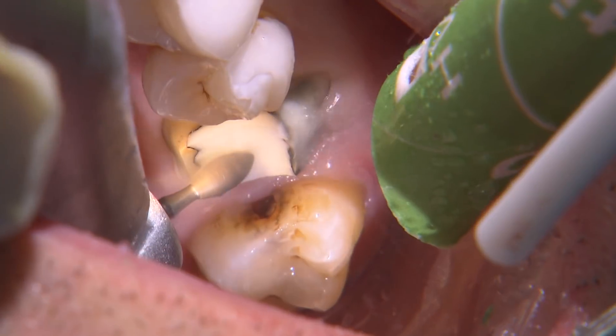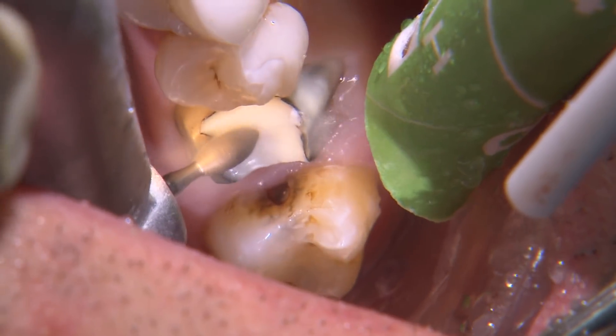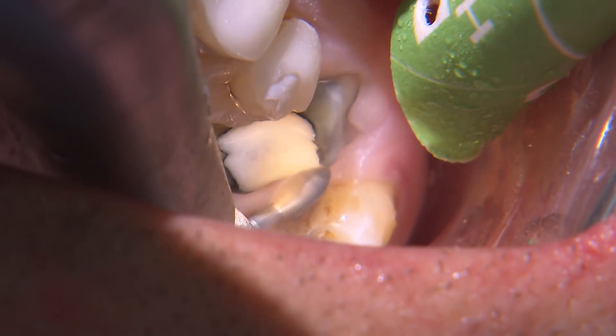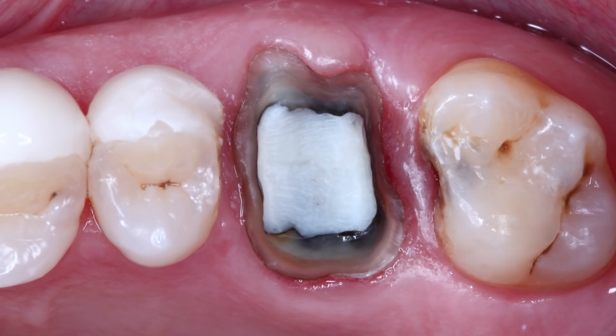The good news is that the patient wants to replace his veneers anyway for something more aesthetic, so at least we got a head start on that. Since the tooth super-erupted, I reduce more on the occlusal until the prep is about one and a half millimeters below the adjacent teeth, so the final crown can be in the proper plane of occlusion.